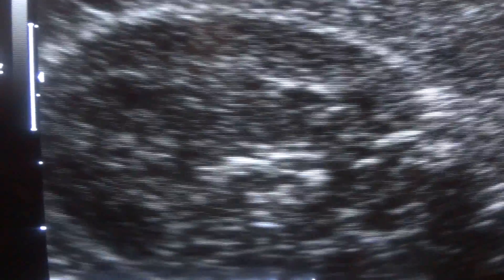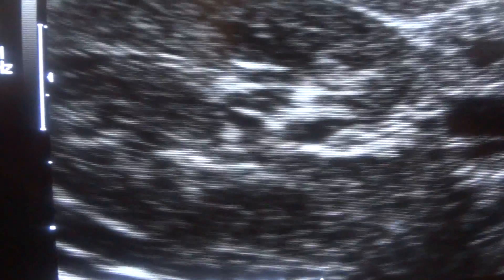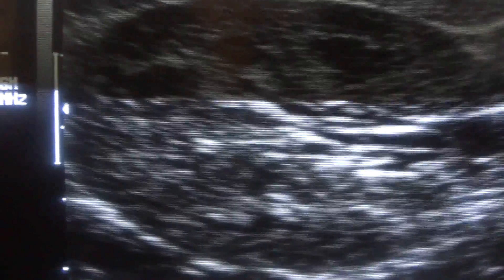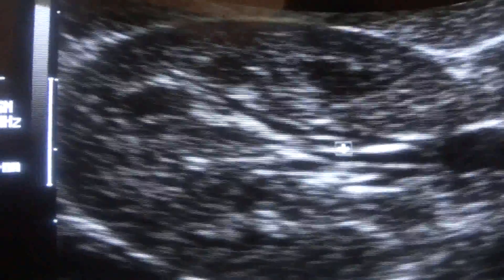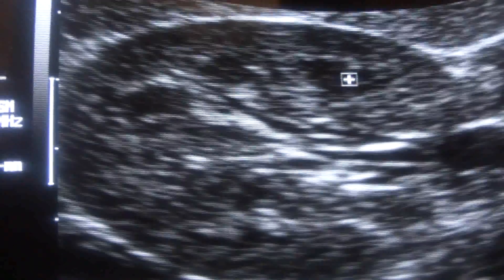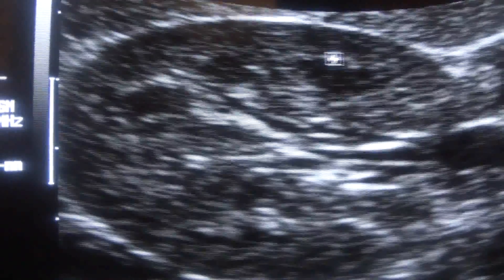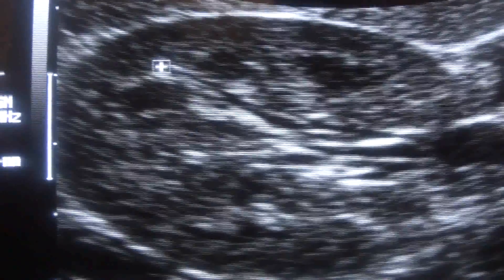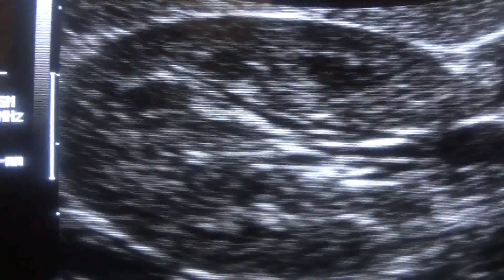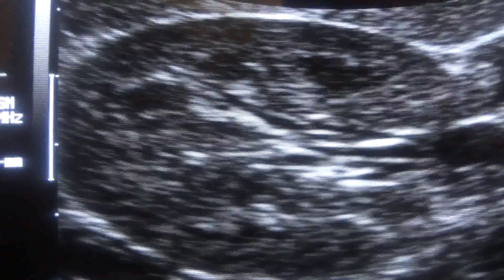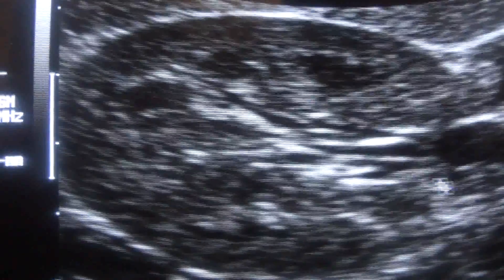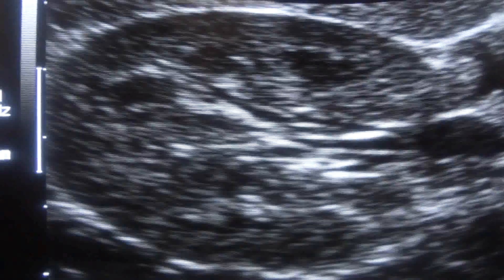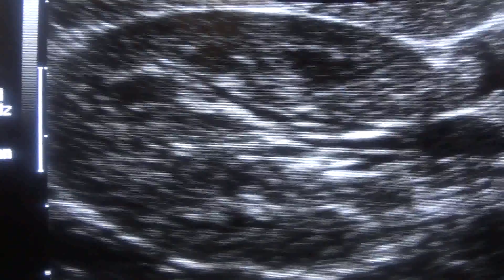This is the pyramid in the posterior medullary region with arcuate vessels. And this is the renal vein entering into the kidney.